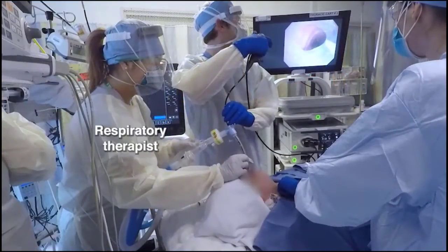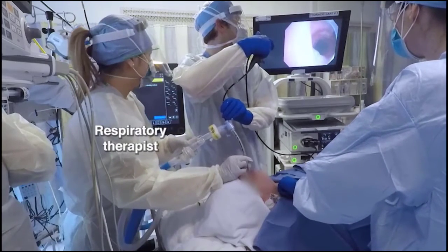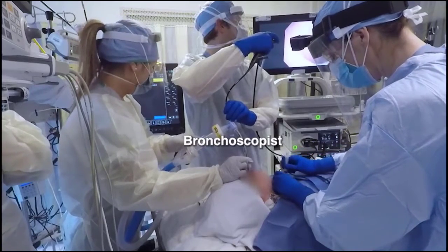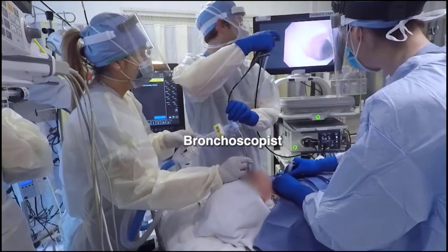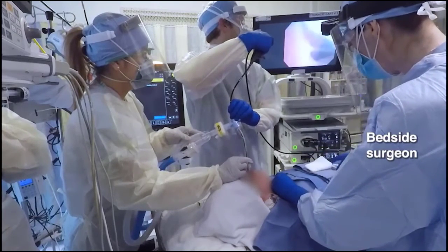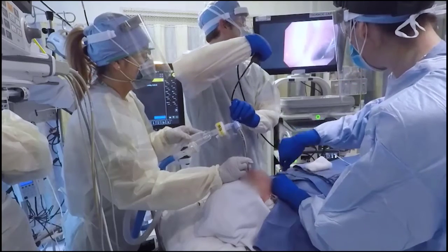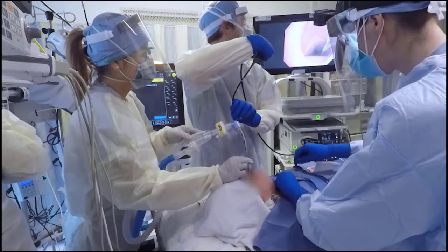The respiratory therapist should stand at the head of the patient's bed, where the therapist will have direct control of the airway and access to operating the ventilator. Position the bronchoscopist at the patient's left side next to the bronchoscopy cart and video monitor. The surgeon should be on the patient's right side with direct view of the bronchoscopy monitor. However, a left-handed surgeon may prefer to be on the patient's left with the bronchoscopist on the patient's right.